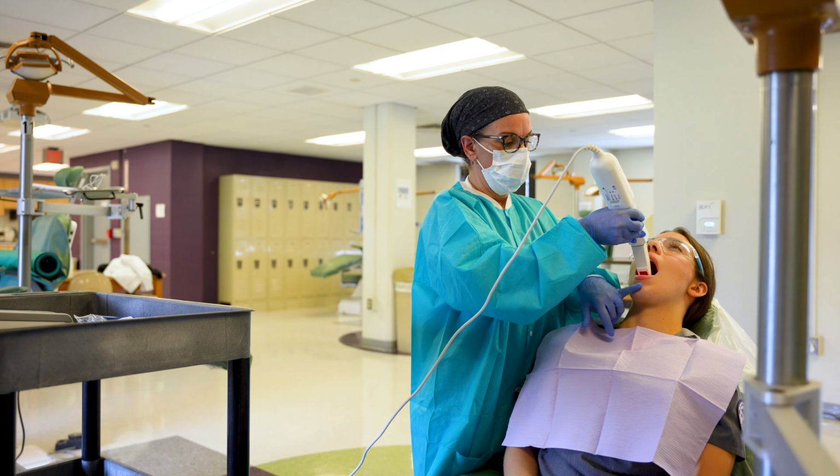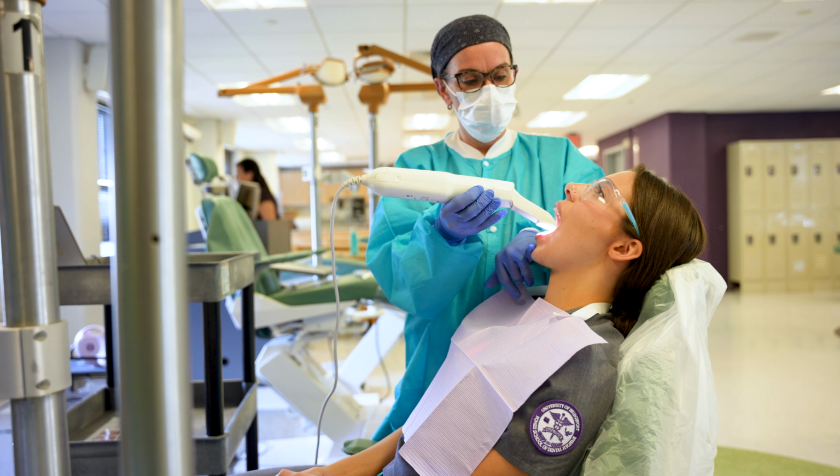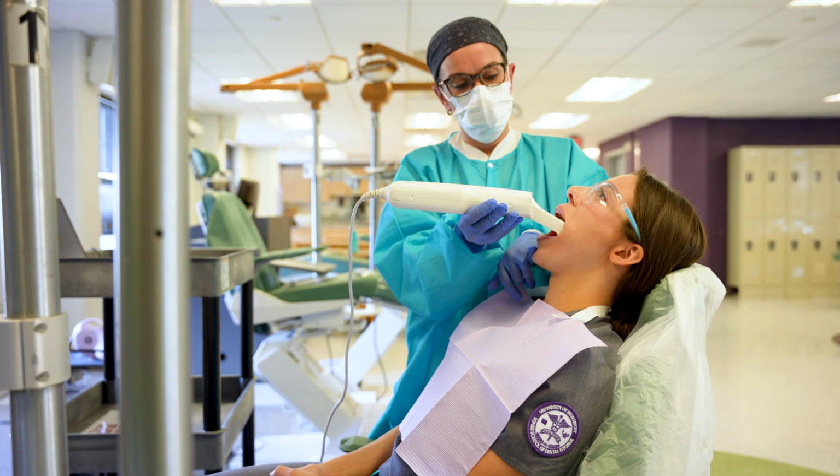The intraoral scanner was one of our newest additions, and that was brought to us because in dentistry, we've kind of phased out of doing traditional impressions. So these days, it's all done through an intraoral scanner. It runs in 3D. It's able to visually impression all of the areas inside of the mouth.